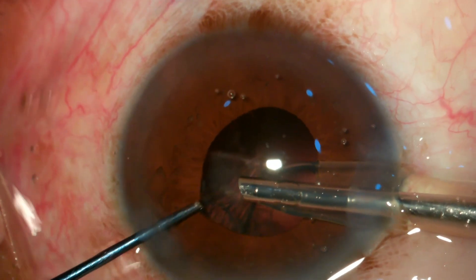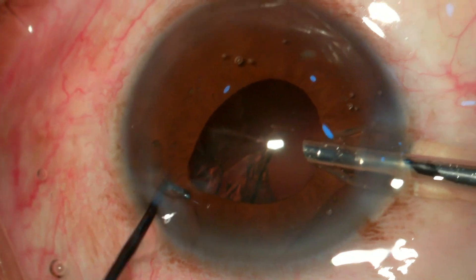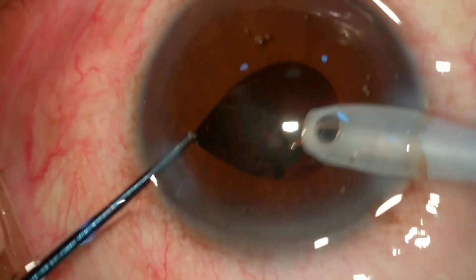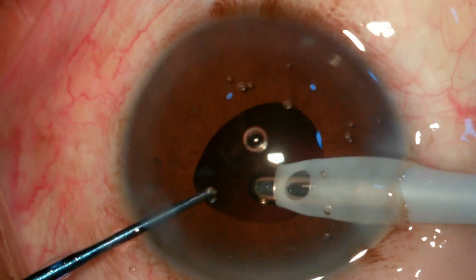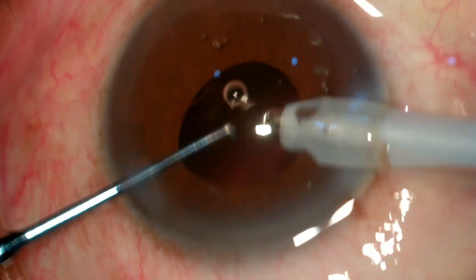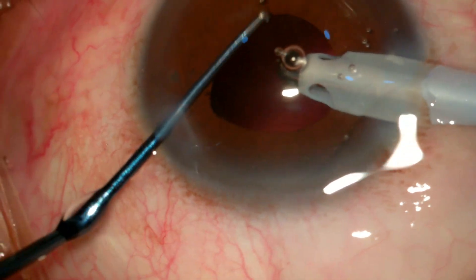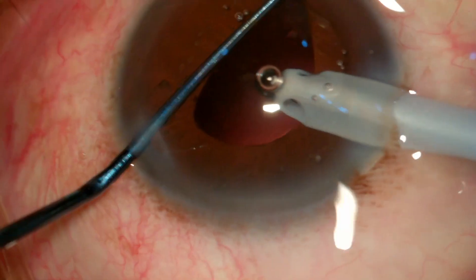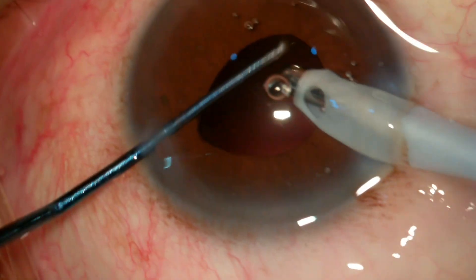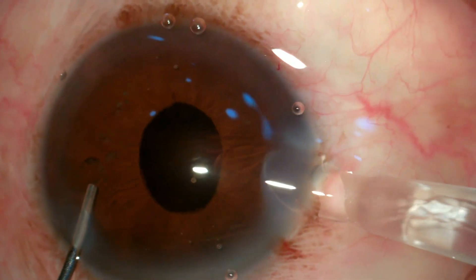This is the end of the phacoemulsification and I have finished it without touching the iris. A little bit of cortical matter remains, so while doing irrigation and aspiration I'm using my blunt tip chopper as a guide — engaging the pupil margin into the chopper, then bringing the I&A tip just below it, engaging the capsule, pulling it towards the center, and then aspirating it.